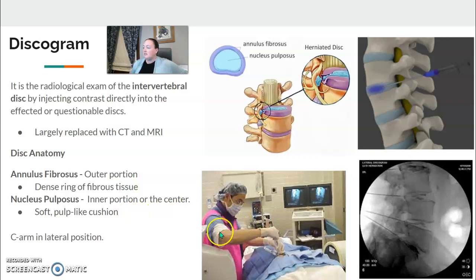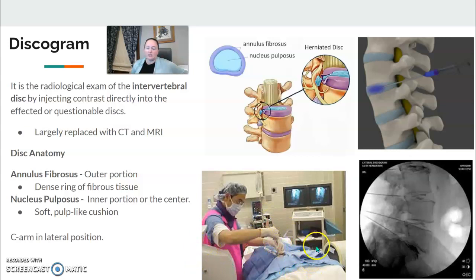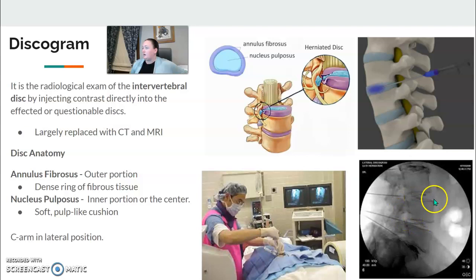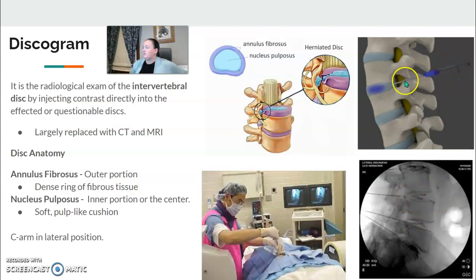The C-arm is placed into lateral position — this one is on a surgical table and swung underneath in lateral position. They inject directly into the intervertebral disc space, as you can see here.